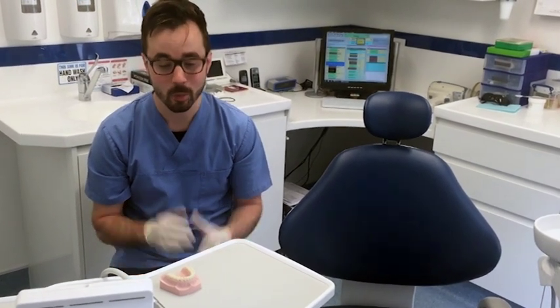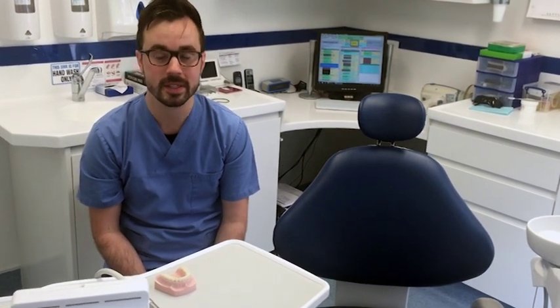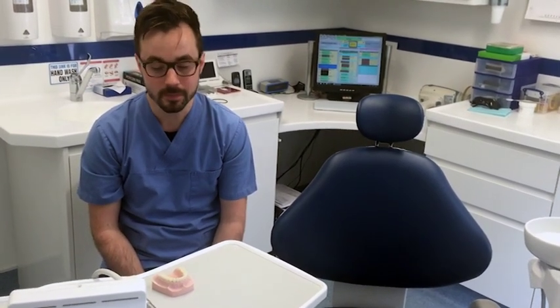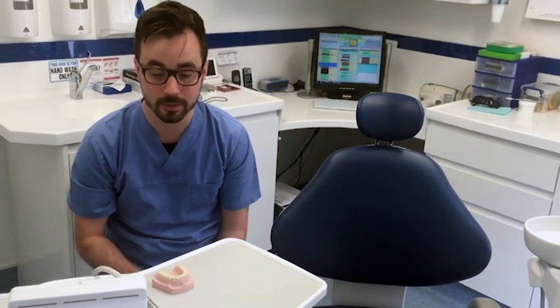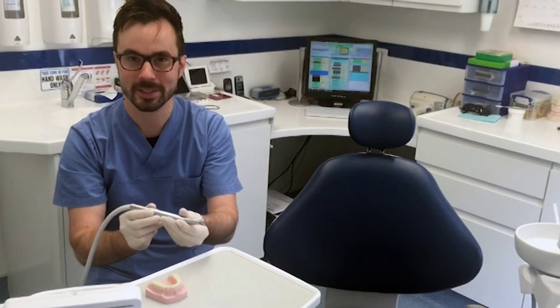Hi, I'm Tom from St Stephen's Dental Practice in Canterbury. We're putting together a video series on some of the equipment that we use day-to-day at the practice. Today I'd like to talk to you about the drill, or as dentists call it, the handpiece.